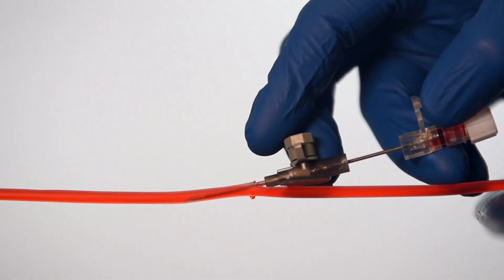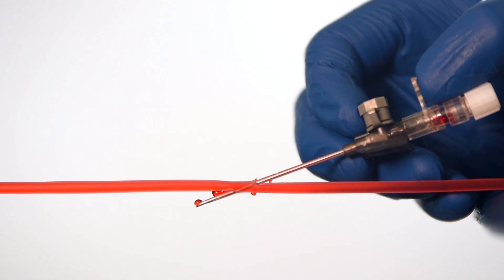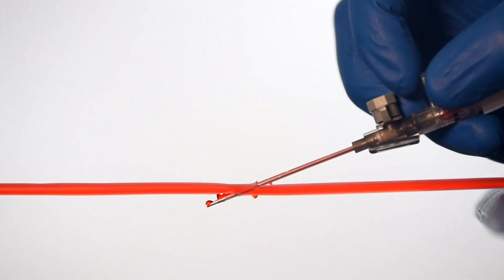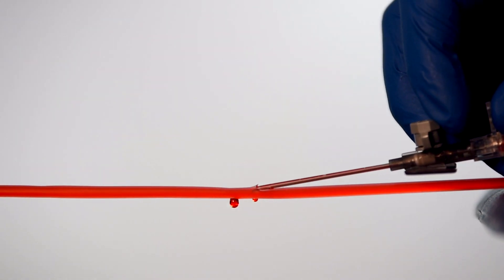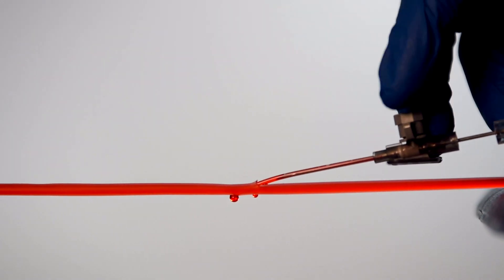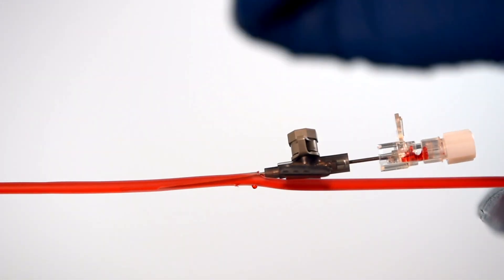Another thing that can happen is transecting a vein. This is when you get into the vein, you get your flashback, and then when you advance the tube off you've actually gone through the back of the vein and you're no longer within it, so you won't see your secondary flashback. What you need to do here is re-advance the needle all the way through the cannula, pull back a couple of millimetres and try to advance the tube off the tip of the needle again. At this point you should see your secondary flashback confirming you're in the vein. If these tips don't work, take the cannula out, pick a different site and try again.